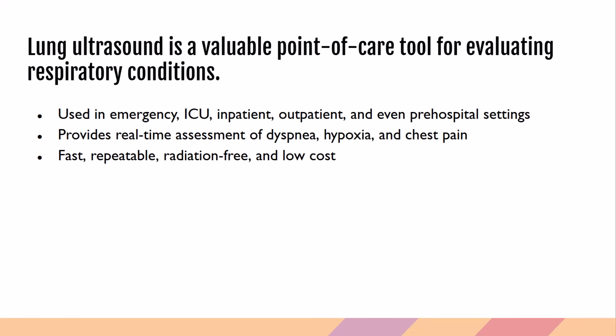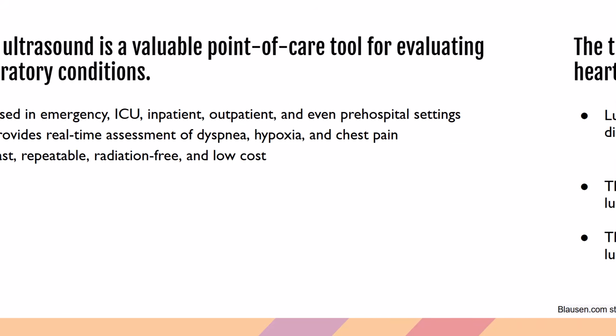When a patient comes in short of breath, they can quickly scan and start narrowing down the differential before a chest X-ray is even ordered. It's especially helpful in critically ill patients or during pandemics like COVID-19.